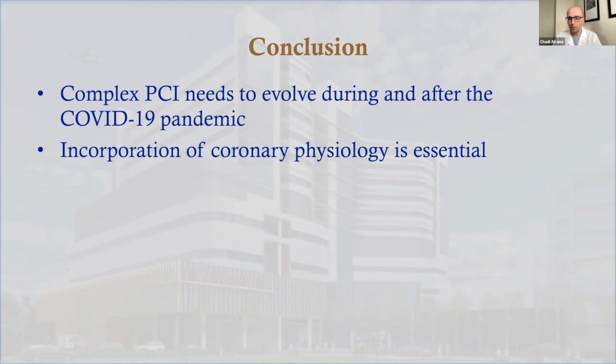Dr. Ang, Dr. Har, any comments? Yeah, I like that last case. I think that your colleagues, not to cast aspersion, but rather than reaching for a stent to treat the circumflex, maybe it would have been more cost effective to reach for an FFR wire for the circumflex and IVUS for the LAD. And it would have saved some headache down the road. That's true. That's very true.